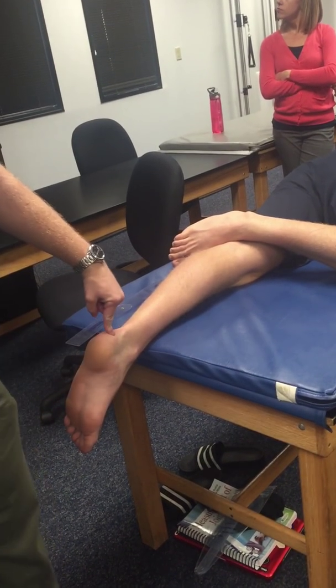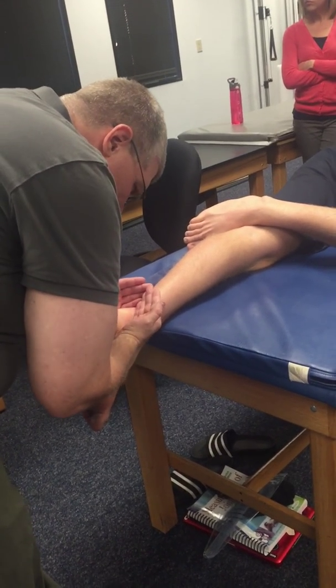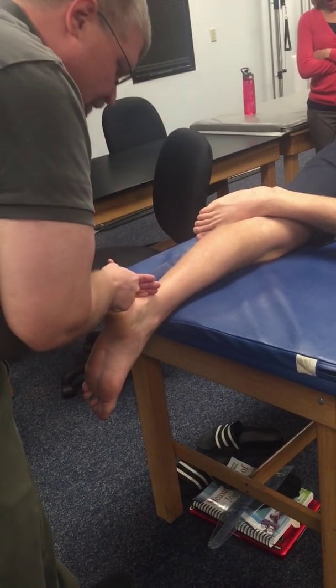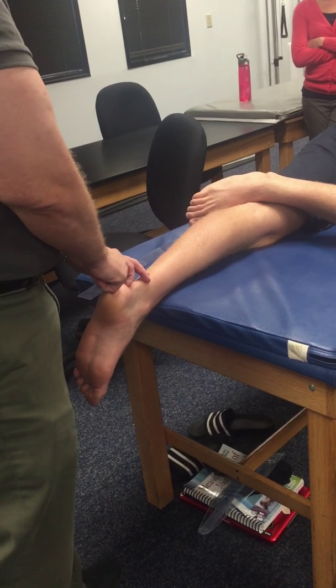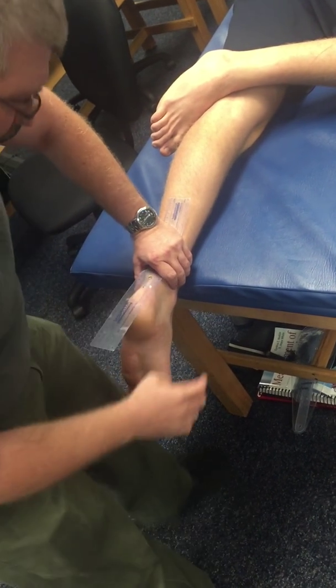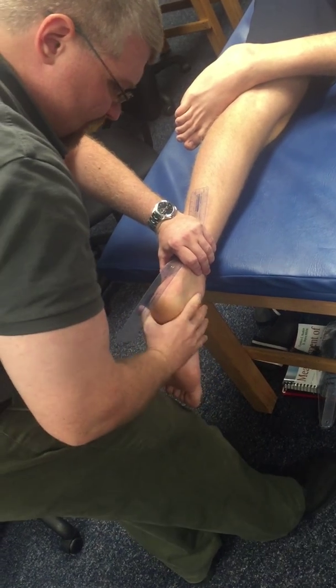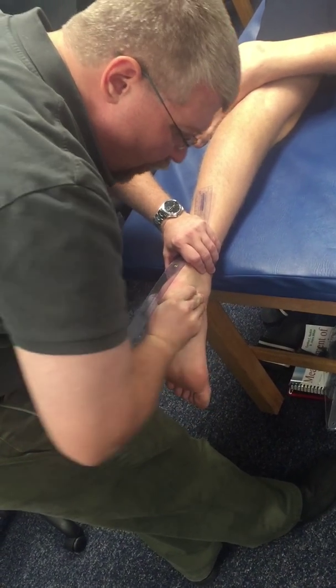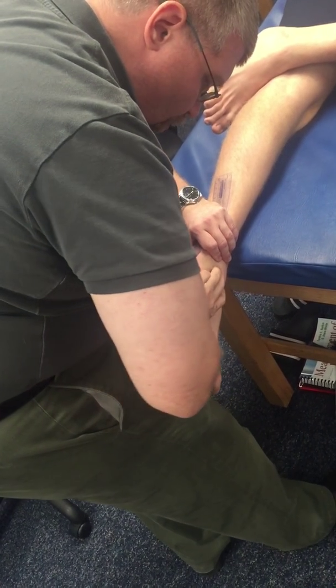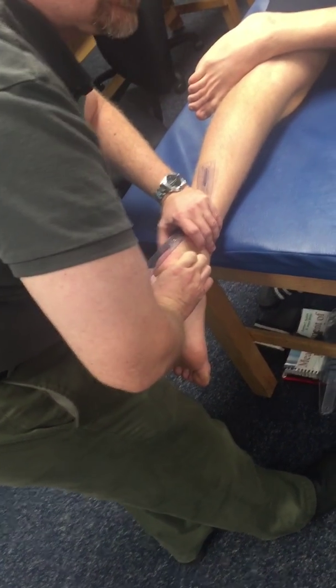The distal arm follows the posterior calcaneus — midline of the posterior calcaneus. I'll outline and shape the calcaneus and try to create a line there, and I might actually put a line on a person if doing this clinically. Find my axis, line up the line I drew on the person with the back of the goniometer, and just move the rear foot — just the calcaneus. Be careful not to let too much of the whole foot come along.